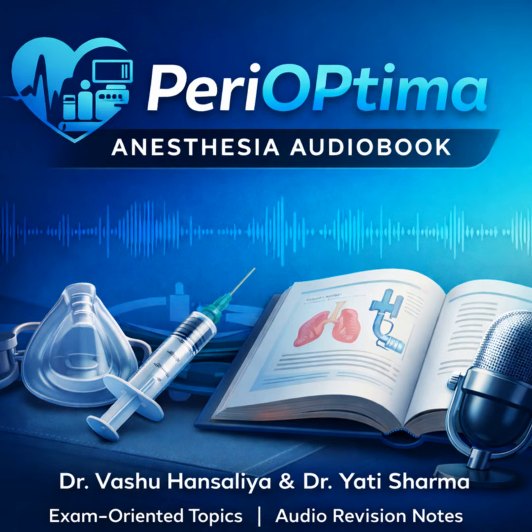Let's do a rapid-fire review in our final section, summary and exam conclusion. Okay, here's the high-yield recap for instant recall. DL, especially the Macintosh, is the standard. It uses the vallecula for an indirect lift. VL offers indirect visualization, bypasses the need for axis alignment, and is superior in difficult airways and for teaching. And the grading: Cormack-Lehane grades IIB and 3 inform you you're in difficult territory. Safety is everything. Avoid dental trauma by using the correct 45-degree lifting vector. Severe laryngospasm is a true emergency that requires a rapid onset muscle relaxant if initial measures fail.